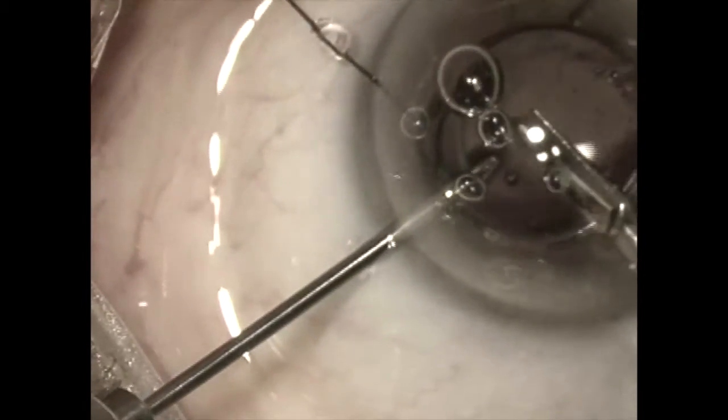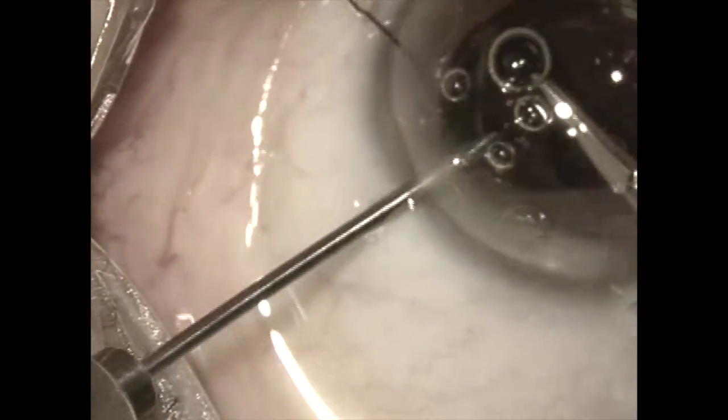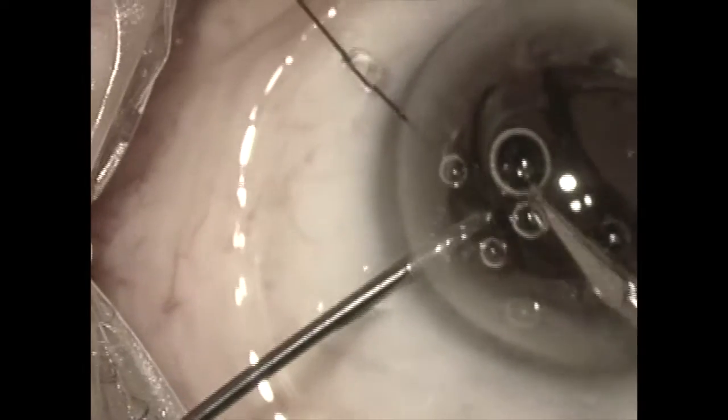This lens cuts pretty easily, and once the cut is complete we can remove each half from the anterior chamber.